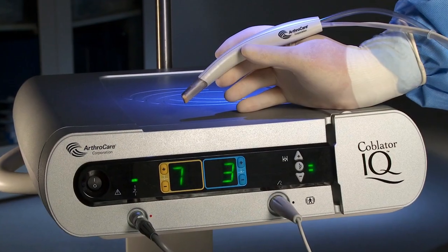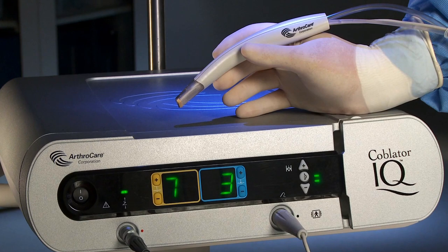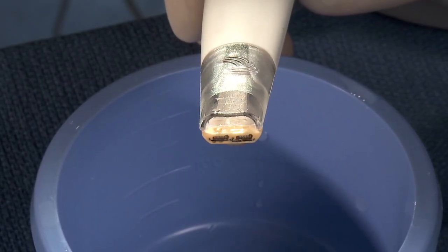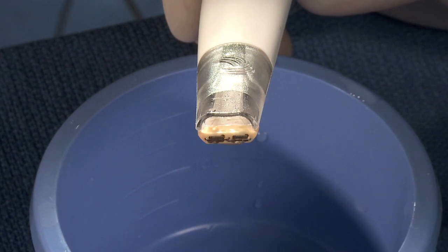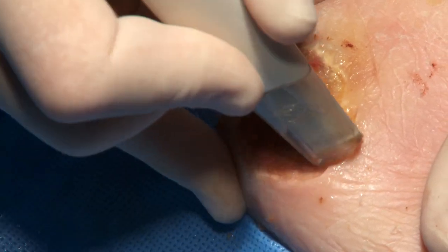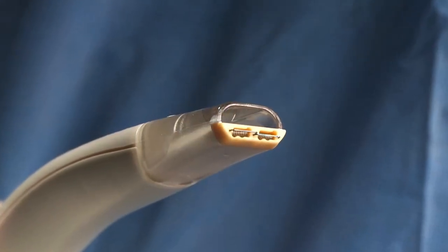The Wound Wand is designed to be used exclusively with the Coblator IQ controller. The Wound Wand debridement device is CE-marked, intended for the debridement of acute and chronic wounds. The active electrode cutting blade and integrated suction lumen, which enable precise tissue removal and maintain a clear surgical field, are located at the tip of the Wound Wand debridement device.